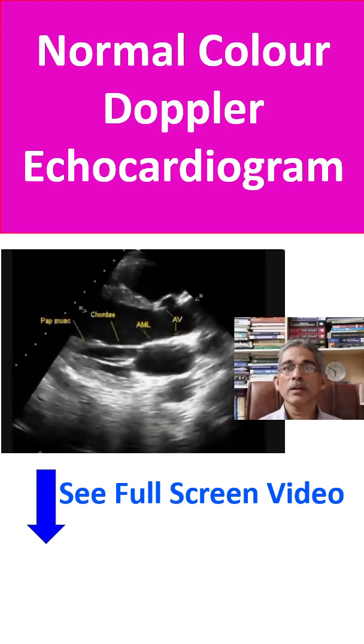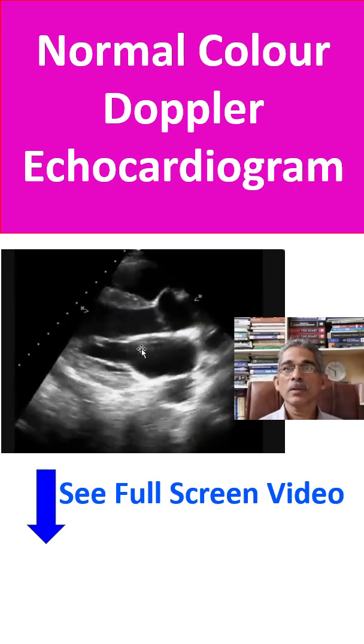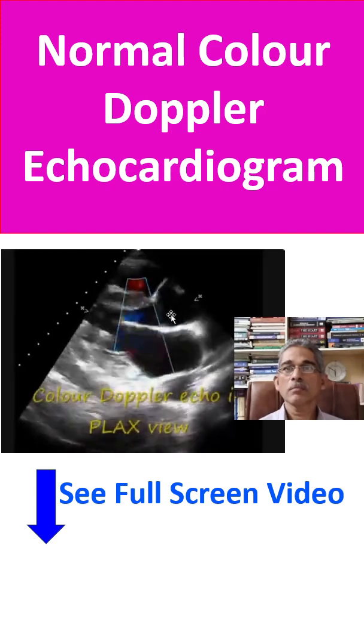Now you can see it, and here you can see the papillary muscle, chordae, anterior mitral leaflet, and you can see the aortic valve there.